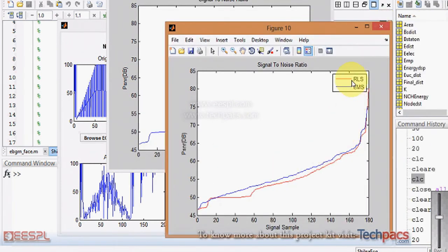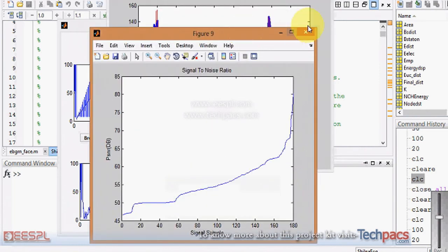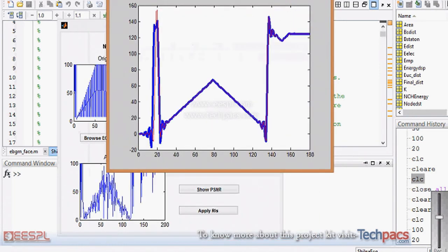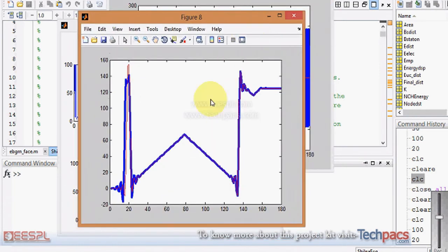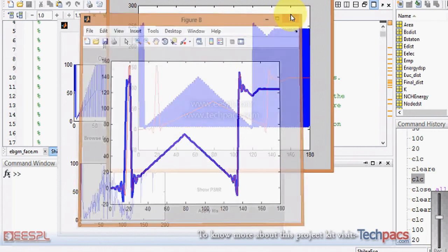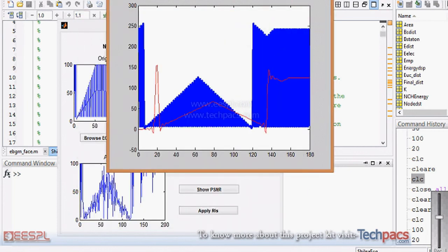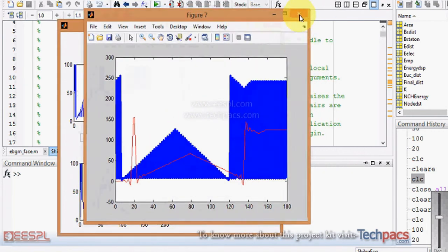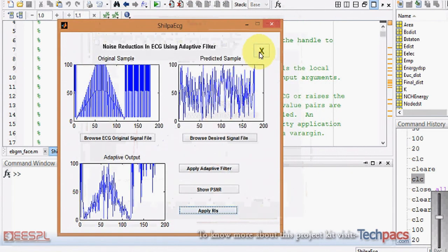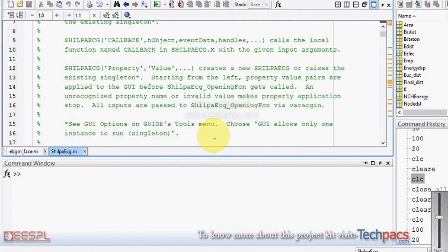It is also showing us the comparison between the two — which one is better, RLS or LMS. As you can see, the peak of the LMS is going above that of the RLS, so LMS is much better than the RLS technique. Some of the peaks in the RLS signal are increased with respect to the original sample, so there is less PSNR with respect to RLS.